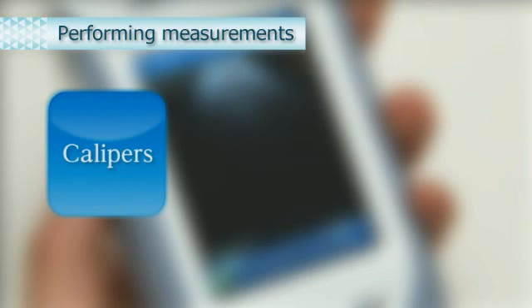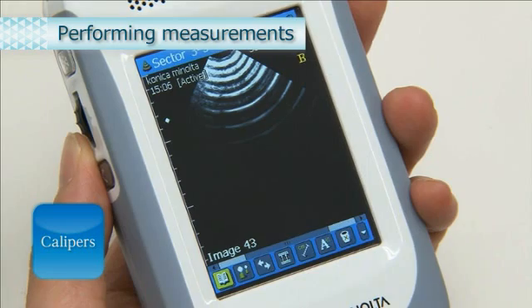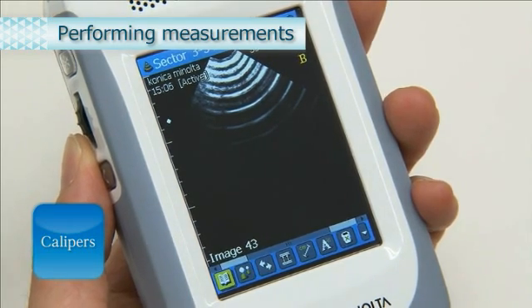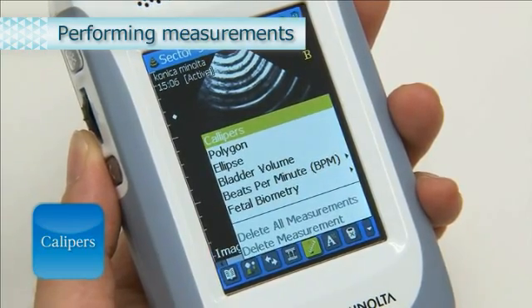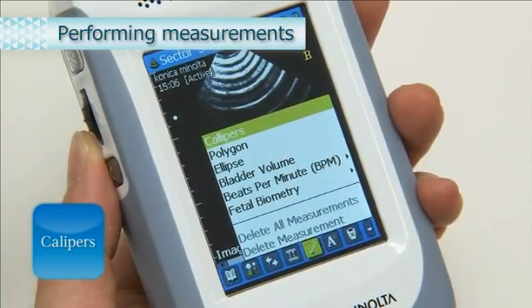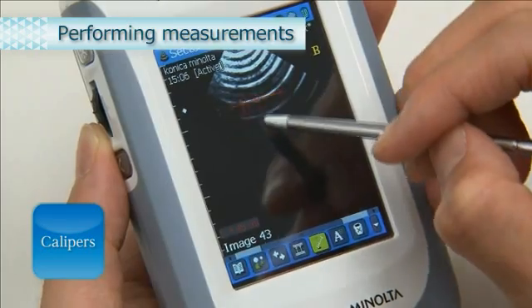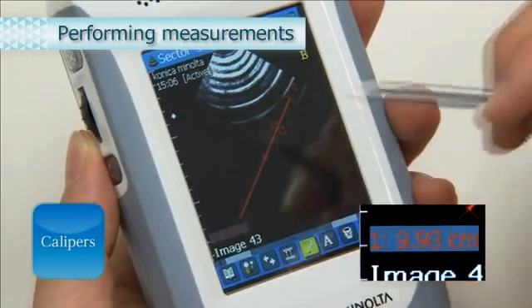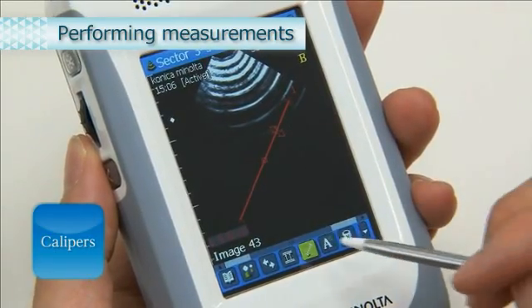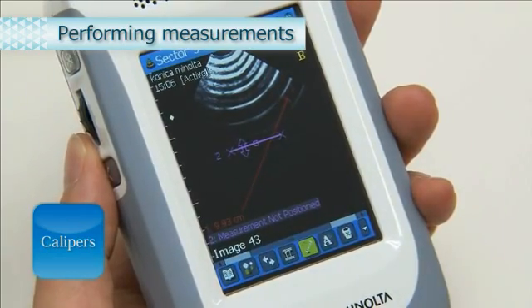We will now explain how to perform measurements using calipers, bladder volume, and beats per minute. For calipers, from the toolbar select the measurement icon. The measurement pop-up menu appears. Select Calipers. When you drag the calipers using the stylus pen, the distance between the two points is displayed at the bottom left of the screen. To measure a second distance, select Calipers again and drag the second set of calipers.